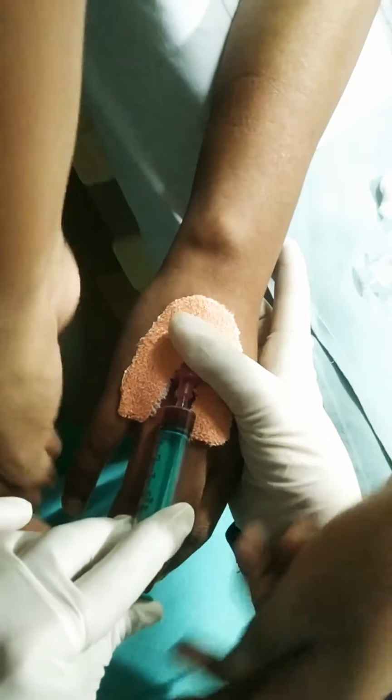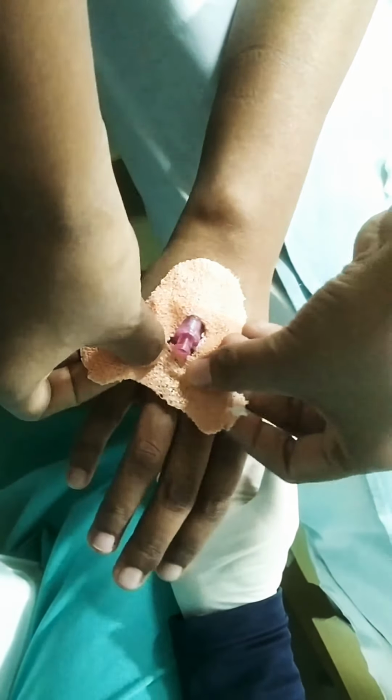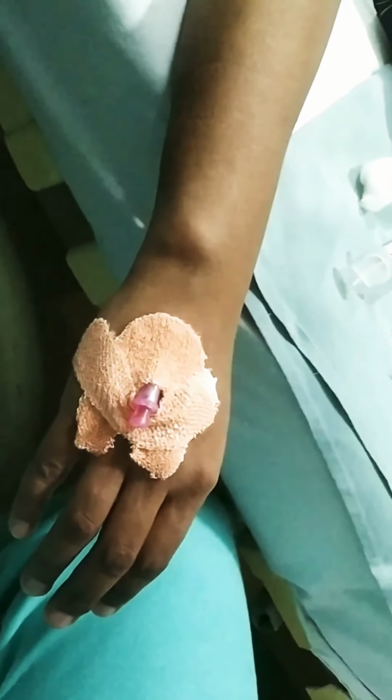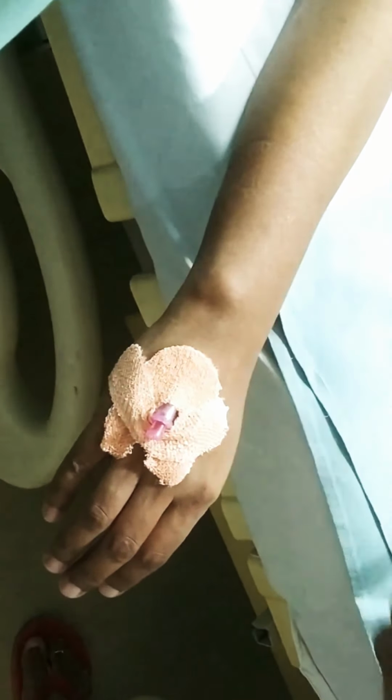Then this cannula is fixed with the easy fix, or you can use micropore or a gauze piece or gauze bandages to fix this cannula. And then write the date of cannulization and stick it to the easy fix, so that we can assess whether it is needed to change this IV cannula or not.